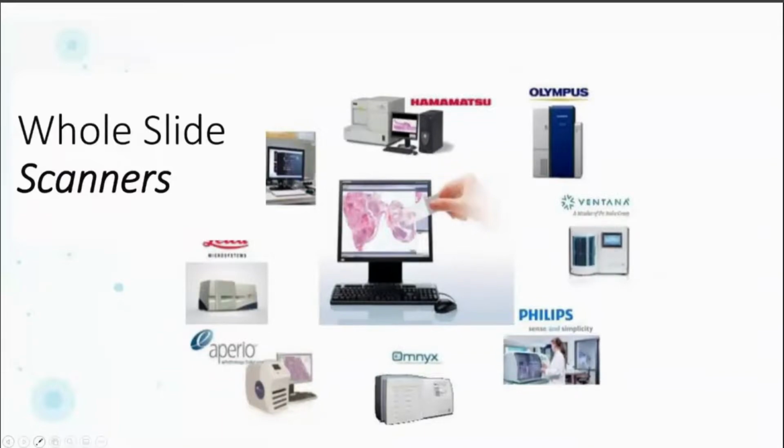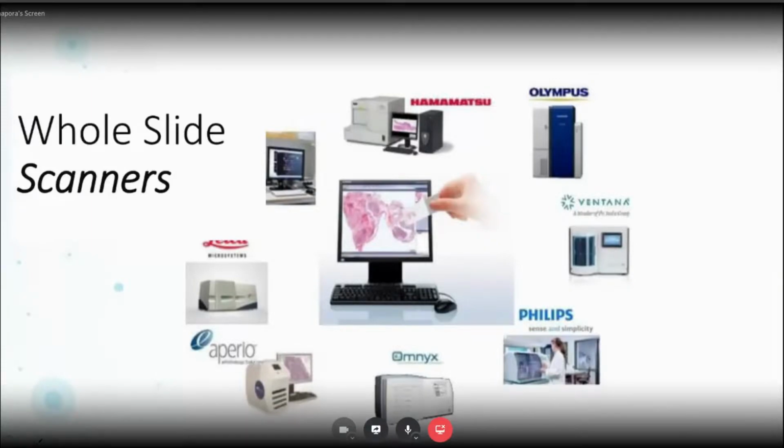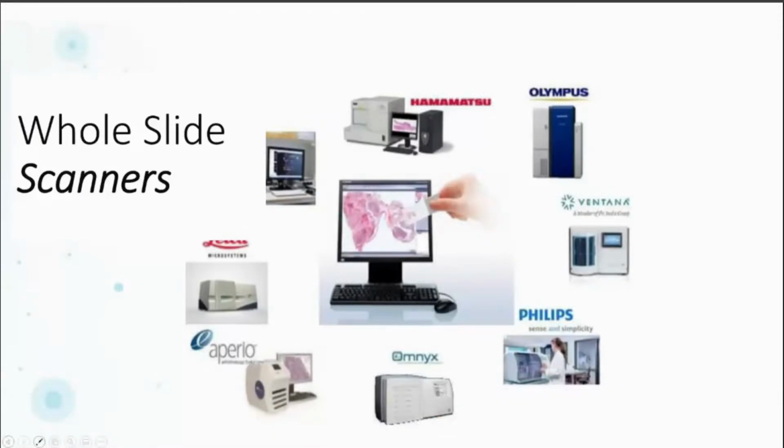And ultimately, that digital asset that's created from the slide scanner can be presented to the pathologist. One of the challenges in the domain is a wide variety of scanners. Over the last 15 to 20 years, as the technology has progressed and as pathologists have been attempting to digitize their work, a number of vendors have come into the market. And so each one of them typically will have a different format for packaging up their slides.